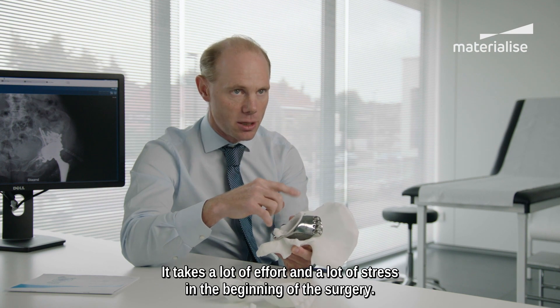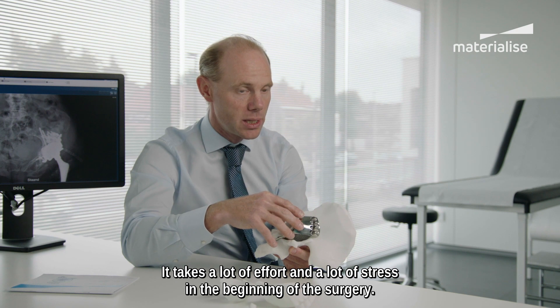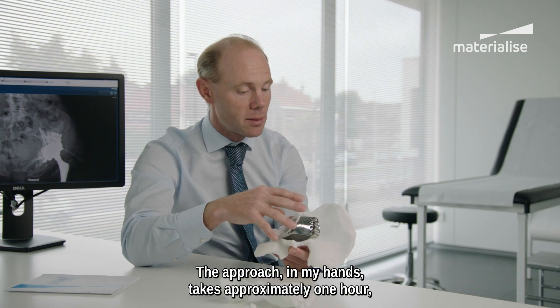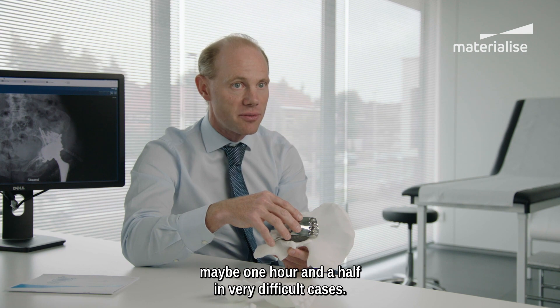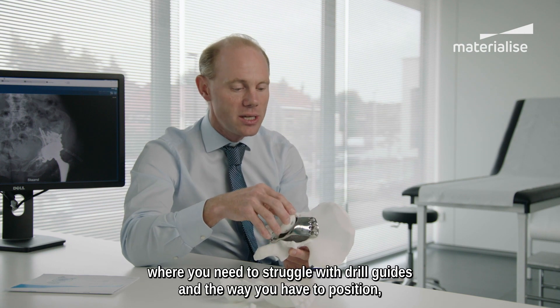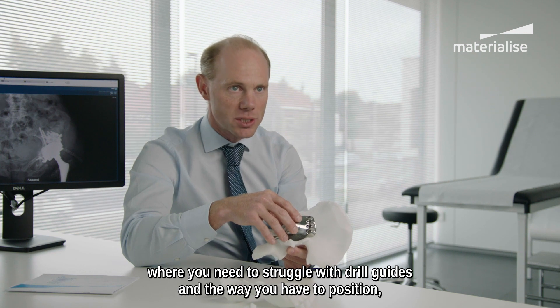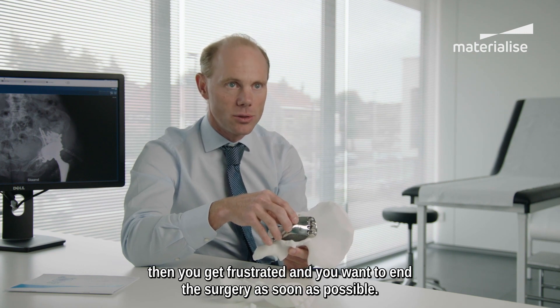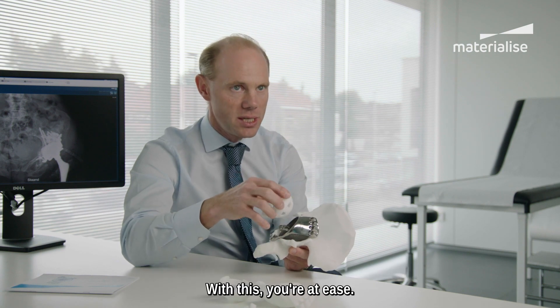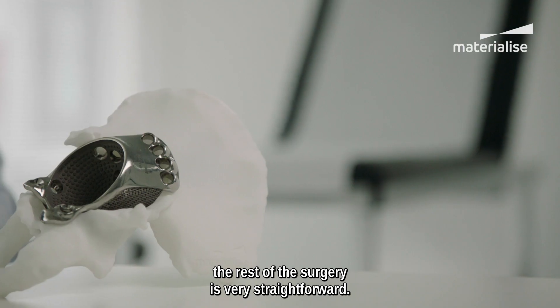Why is this very important? It takes a lot of effort and a lot of stress in the beginning of the surgery. The approach in my hands takes approximately one hour, maybe one hour and a half in very difficult cases. If you have another one hour and a half where you need to struggle with drill guides and positioning, then you get frustrated and you want to end the surgery as soon as possible. With this, you're at ease. You know if the bone has been prepared very well, and the rest of the surgery is very straightforward.